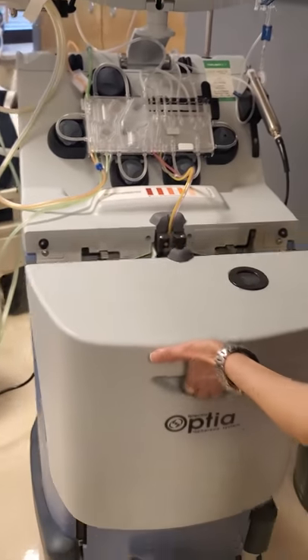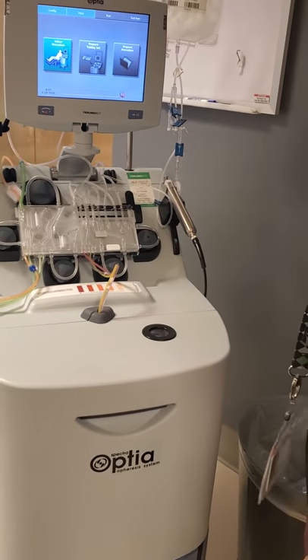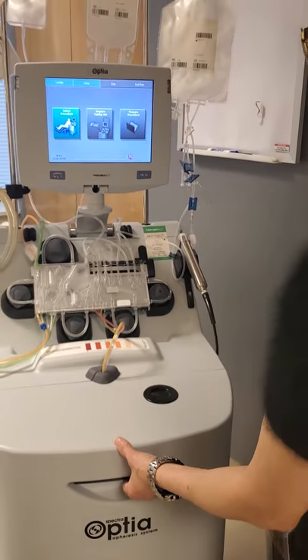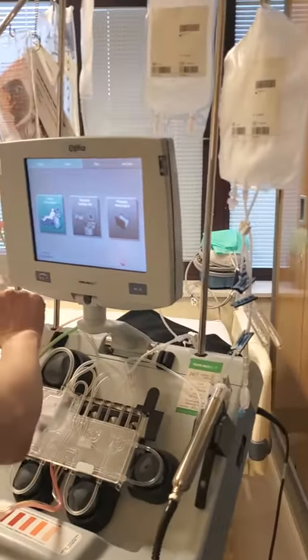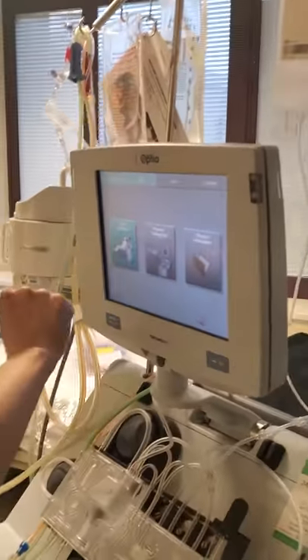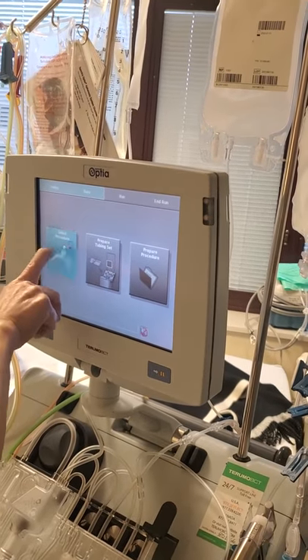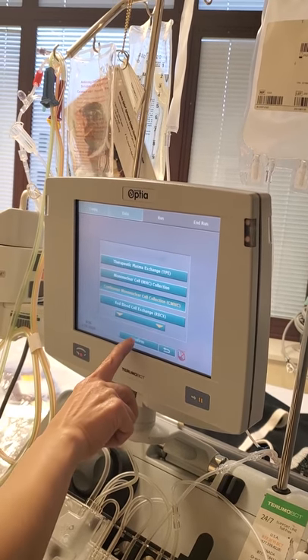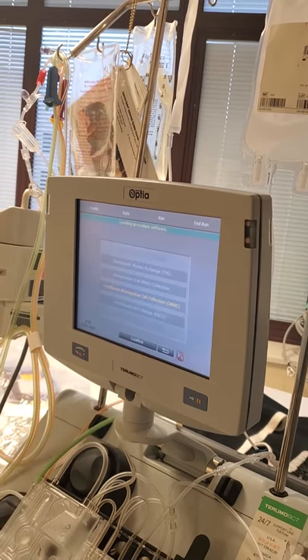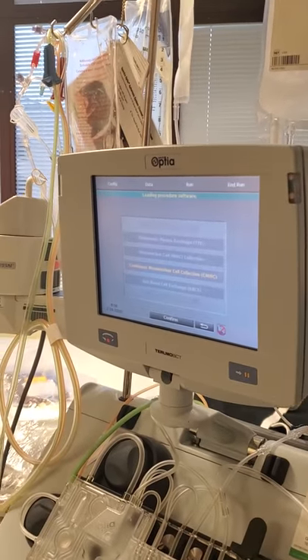And then you close the door. Now we're going to go backwards to the screens that we failed to access while you were putting plastic on the machine — it's a lack of procedure. CMNC is selected. The software is loaded after you confirm the choice.